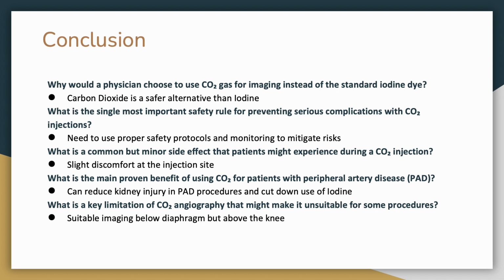What is a key limitation of carbon dioxide angiography that might make it unsuitable for some procedures? And that would be that it's suitable for imaging below the diaphragm, but above the knee specifically.